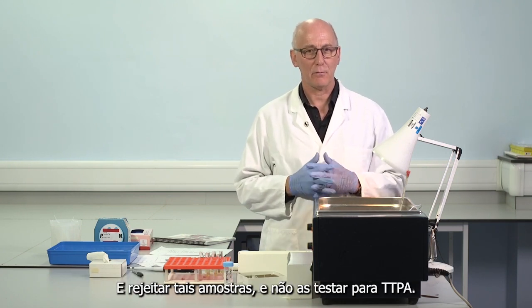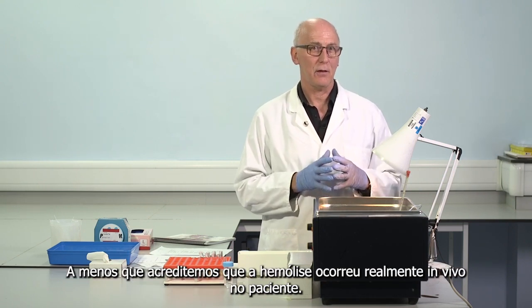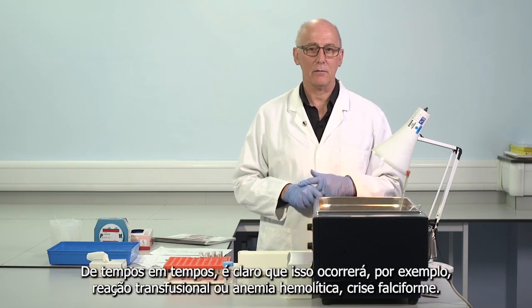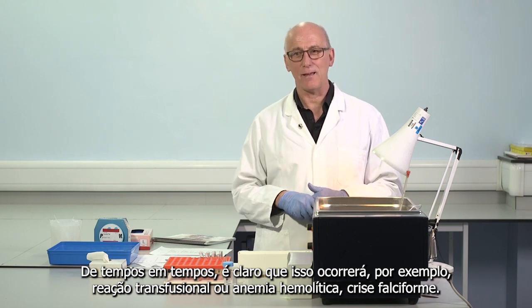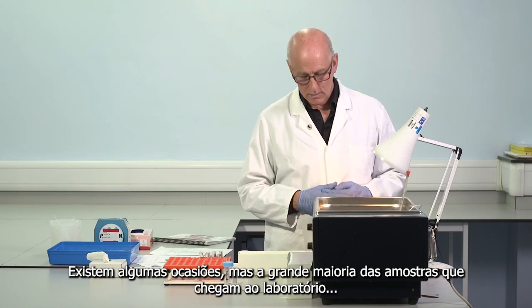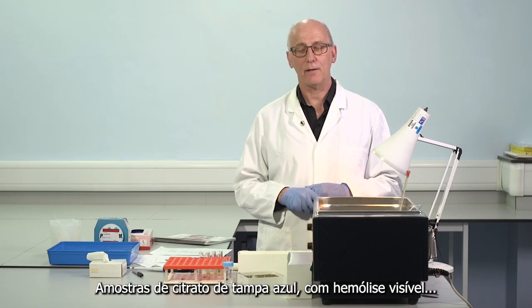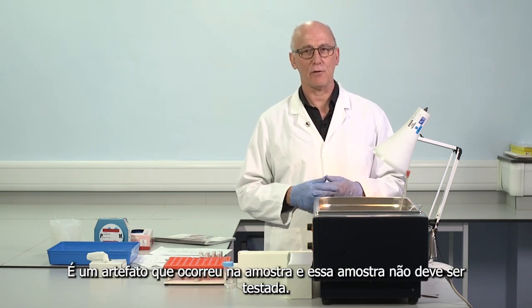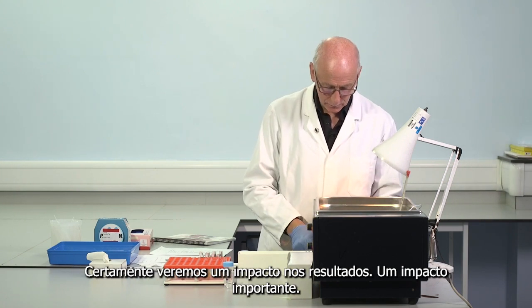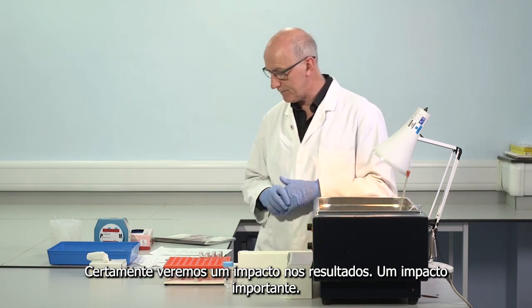So in my opinion, it's absolutely essential to have robust checks in place to detect hemolysis and to reject such samples and not to test them for APTT unless we believe the hemolysis has occurred actually in vivo in the patient. From time to time, of course, this will occur: transfusion reaction, autoimmune hemolytic anemia, sickle cell crisis, there are some occasions. But the vast majority of blue top citrate samples arriving in the lab with visible hemolysis, it's an artifact, it's occurred in the sample, and that sample should not be tested. We will absolutely see an impact on the results, an important impact.